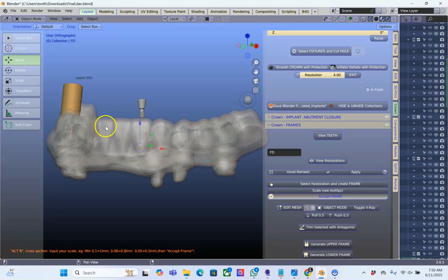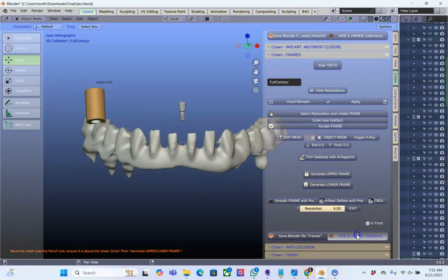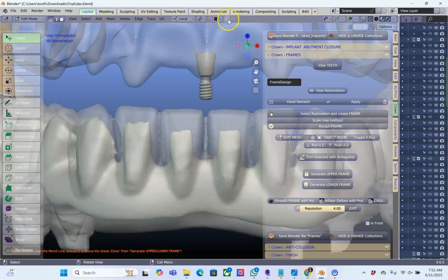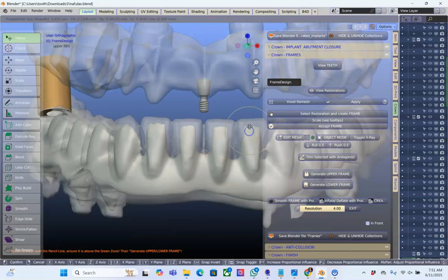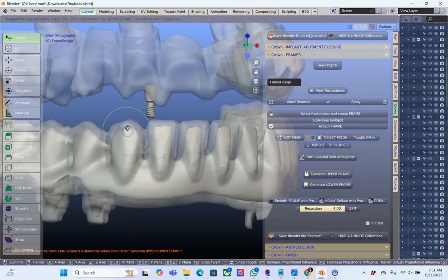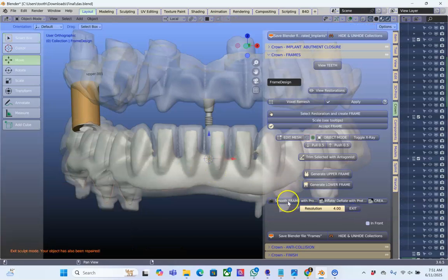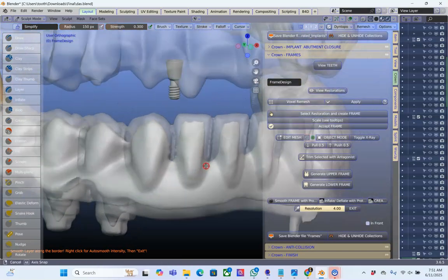So here we can see how it's reduced it. I'm going to briefly go and look at the full frame. I'm going to select that tab, go here proportional editing, and I'll just lift this up just a little bit here, like that. Okay, very easy to do once you know how to do it. Okay, we're going to just smooth this down a bit. And this is all done before you connect it to the implants.